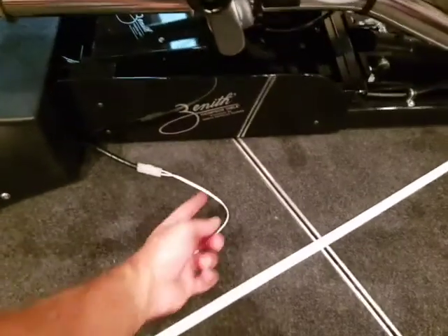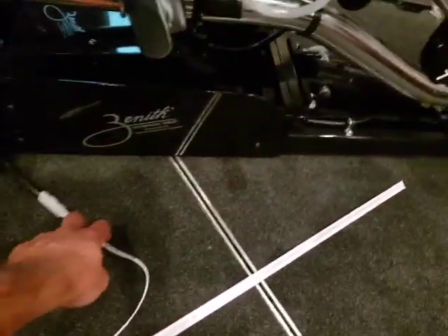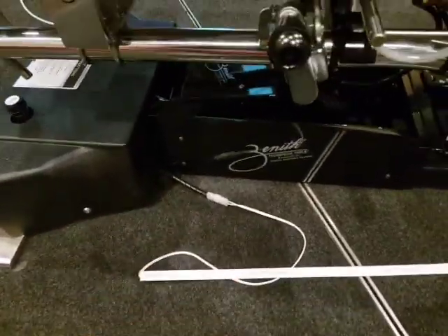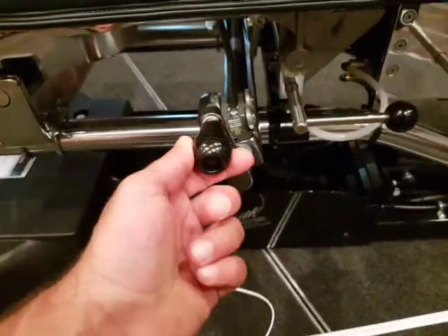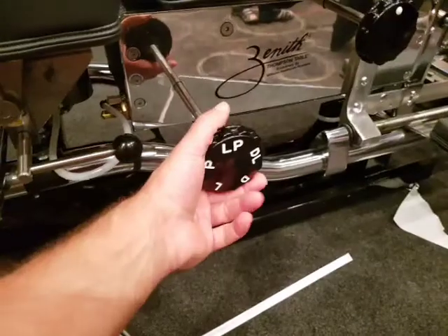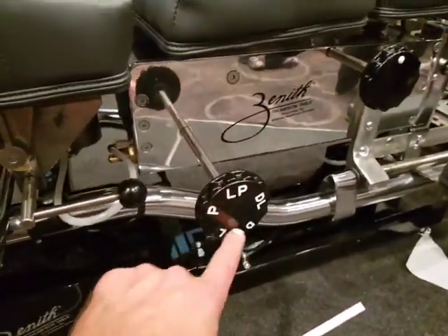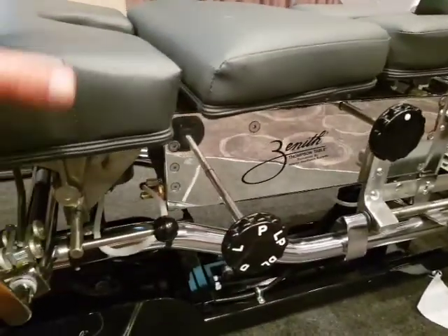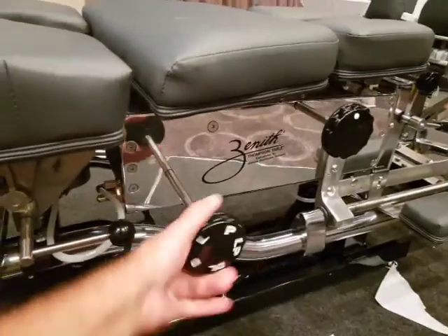When you get the table, you'll see that the switches need plugging in on the sides — it'll just be a case of push in, easy peasy. These are already installed so you won't have to worry about them. Just as a refresher, all of these refer to lumbopelvic, so these two sections of the table go together.